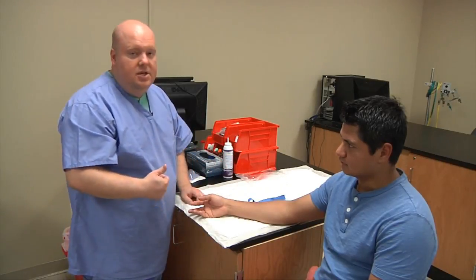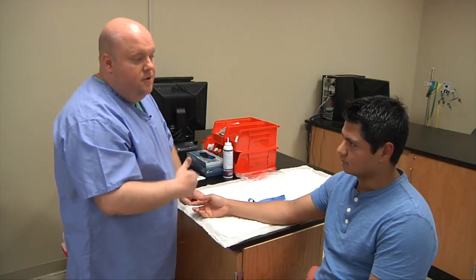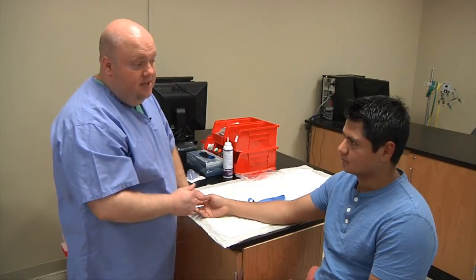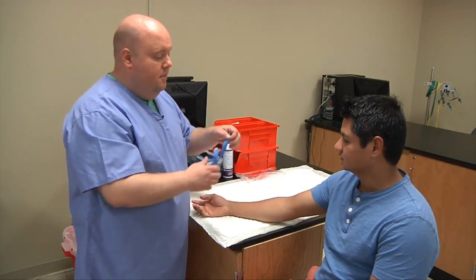Once you've done that, you'll greet your patient and tell them who you are. For example: 'Hi, I'm Trevor, I'm from the lab today. The doctor has ordered some samples from you — do you mind if I go ahead and take a look and see if we can get these samples?' Patient gives consent, so let's go ahead and begin our procedure.